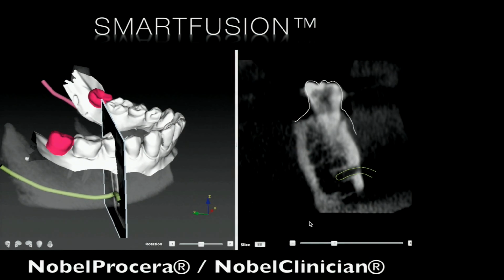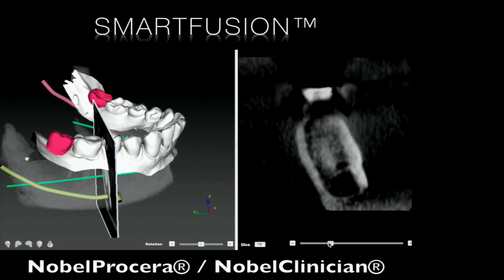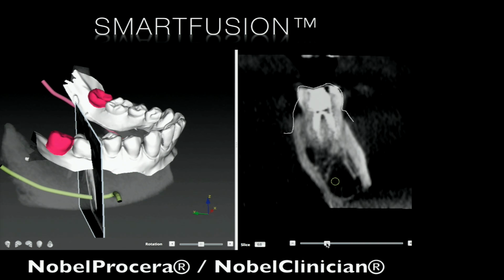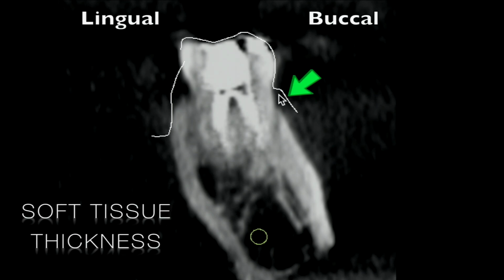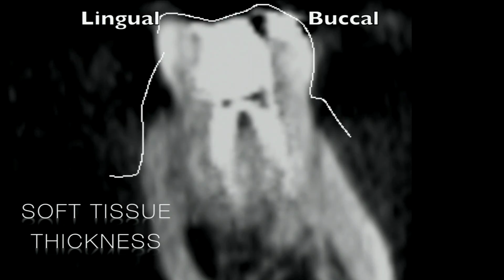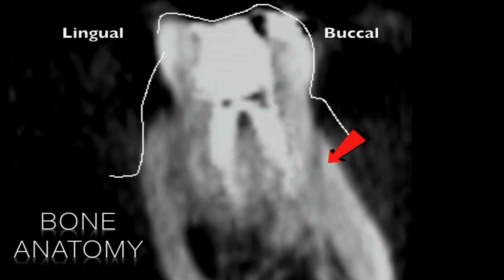So as I look at this case, I can now do what's called a smart fusion. So bringing a model back that was scanned at my lab, I can bring it back in and put it into the 3D imaging software. So I'm able to see both the model and the 3D image at the same time. So I can check out how thick the soft tissues are on the buccal lingual. I can also see the bone. I can see the buccal bone. If you look down in this particular aspect, it's quite thin on the buccal. So if we go to the lingual, we can actually see that the lingual bone is very thick.